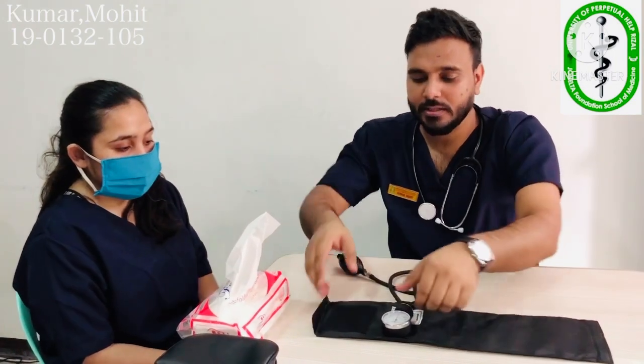Now I'm going to demonstrate how to take the patient's blood pressure. Because this is COVID time, we have to sanitize our patient and ourselves — we have already done that. So I'm going to demonstrate this on my patient, Ms. Dubay. First, I am going to take permission: do I have permission to check your blood pressure? She has given me permission.